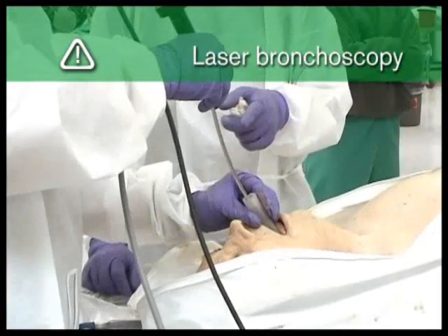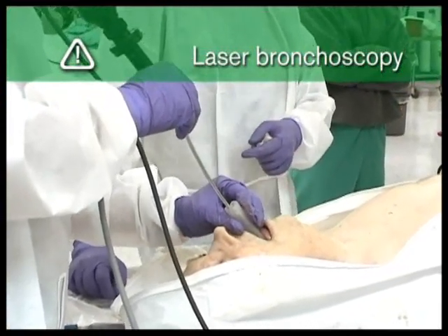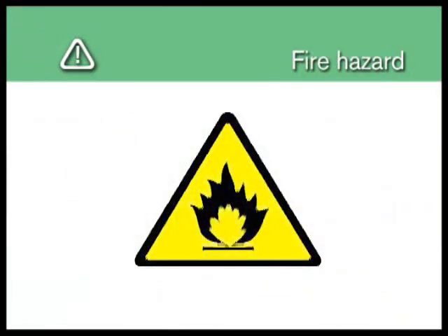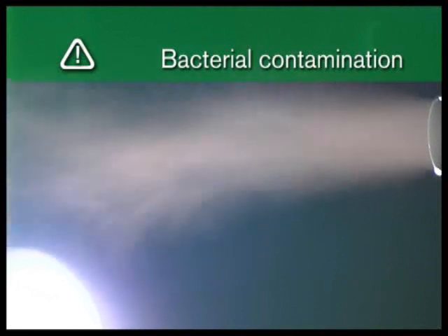During laser bronchoscopy, minimum levels of supplemental oxygen should be used to avoid intratracheal ignition. Fire hazard is increased in the presence of increased oxygen concentrations. Bacterial contamination associated with certain nebulization and humidification systems is a possible hazard.